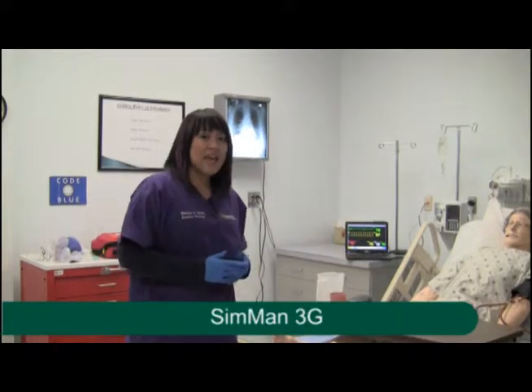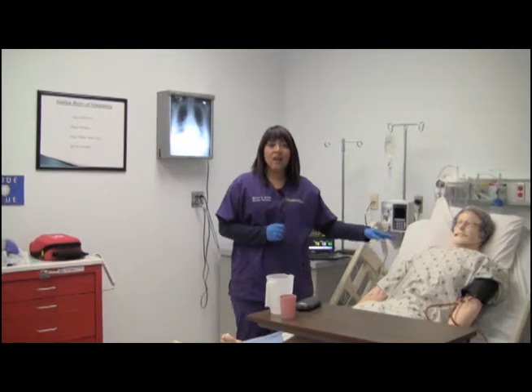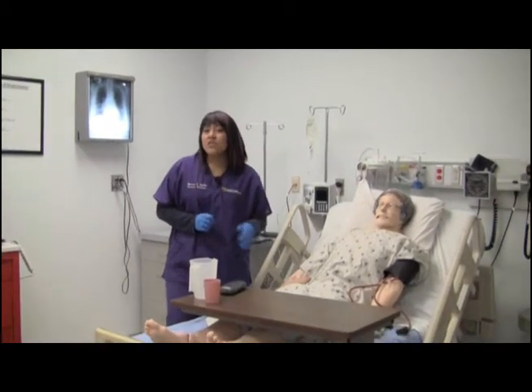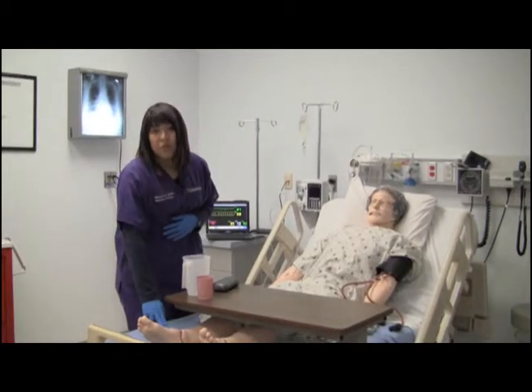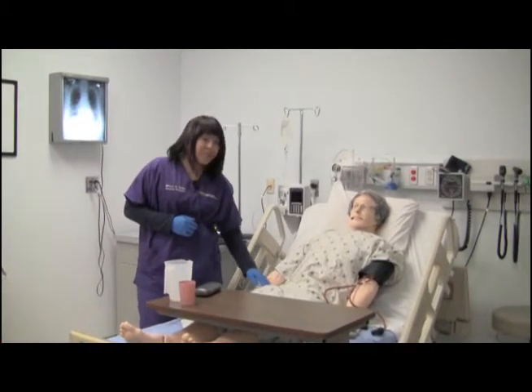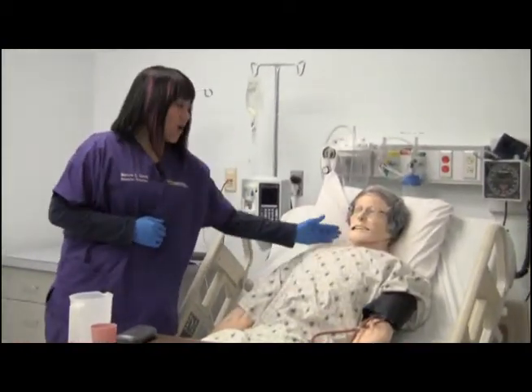In this next patient room, we have Laerdal's SimMan 3G. Similarly to SimBaby, you can auscultate heart and lung sounds. You can also auscultate bowel sounds. You can check his various pulses. We have pedal pulses, popliteal, femoral, radial, brachial, and carotid.